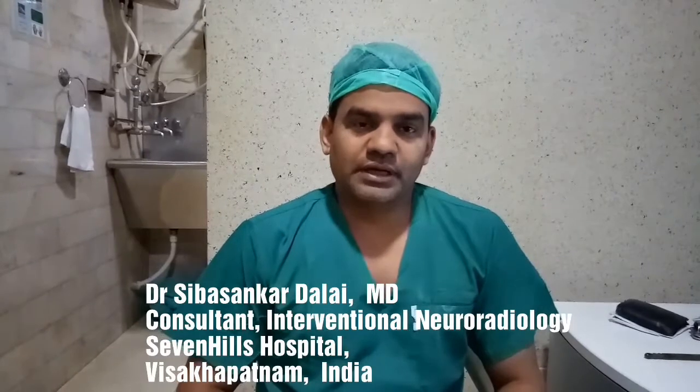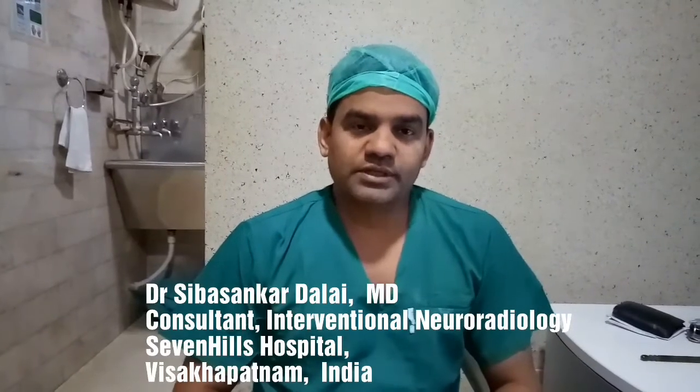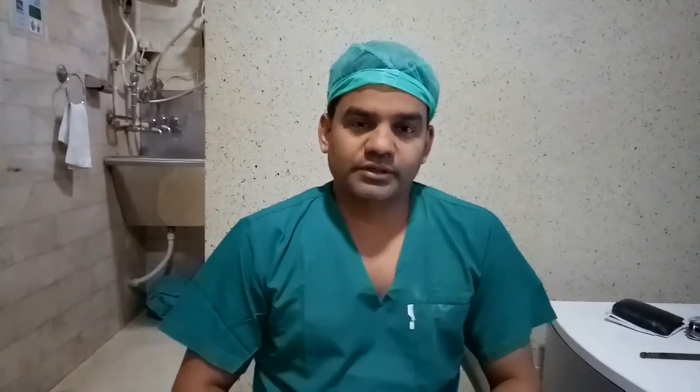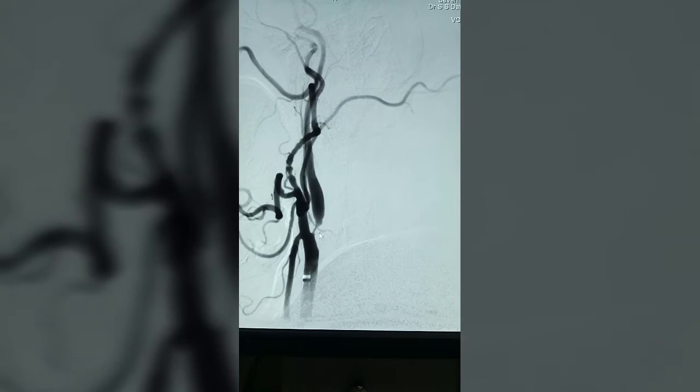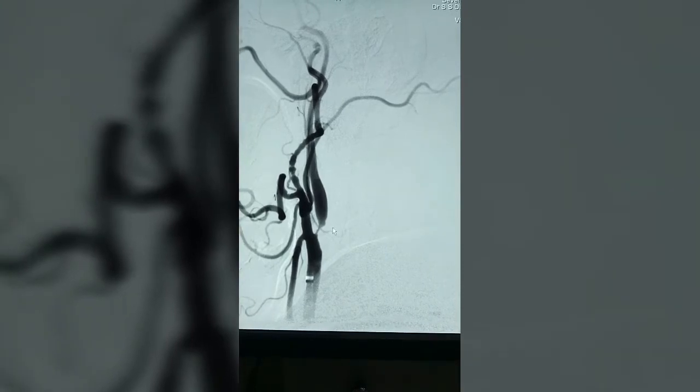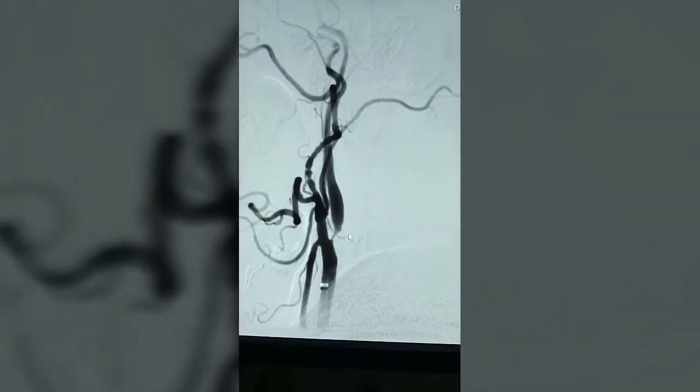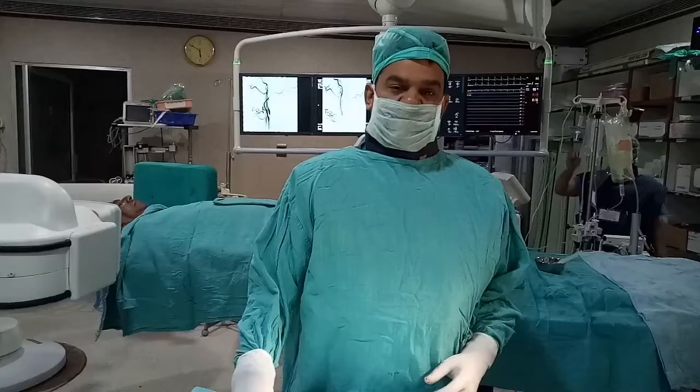We are going to do carotid artery stenting with distal embolic protection in this patient today, which will prevent subsequent TIA and stroke. This is the right common carotid artery angiogram demonstrating a critical stenosis of the right ICA origin, and this needs to be treated, which we are going to do today.